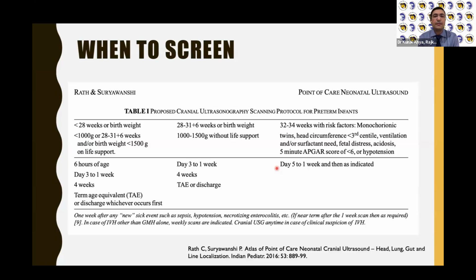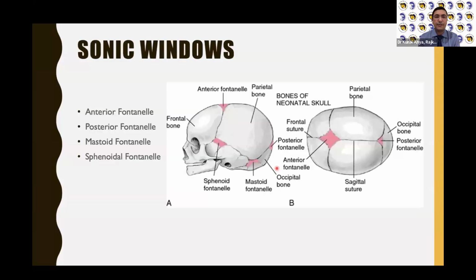Any baby who is between 28 to 32 weeks or between 1 to 1.5 kg, we scan between day 3 to 1 week, at 4 weeks, and at term gestation. And any baby who is above 32 weeks and has any complication, we do it between 5 days to 1 week of age.